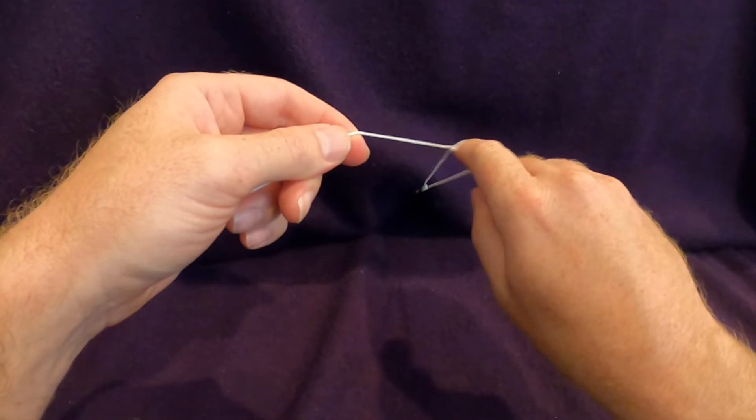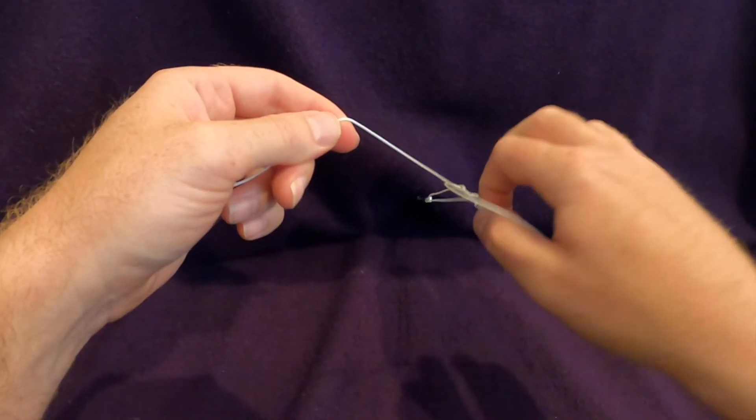You have to briefly let go of the suture before regrabbing it so that you can pull it through and tighten down the knot.